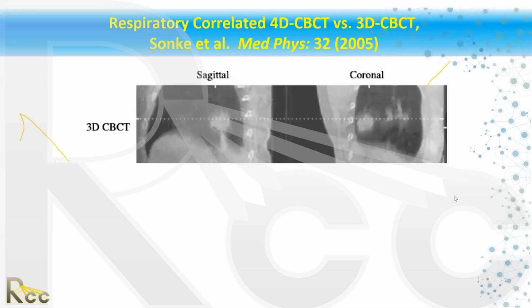Yeah, so it's 2 millimeters for us. We follow the 2 millimeter workflow, and then I think it's 2 or 3 degrees for the rotation. We try to keep things consistent with the task group report requirements too. So we generally keep it within 2 to 3 millimeters.